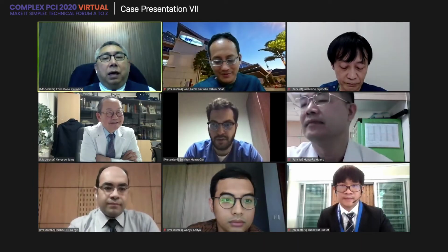Very good. Actually, do any of the panelists or presenter here have Impella in your country? I think this case would be an ideal case for Impella support as well. Of course, Michael managed to do it quite beautifully and smoothly without any Impella or mechanical support. But in our centers, I think definitely it would be a case with Impella support, because in case anything went wrong, we can still salvage the patient.